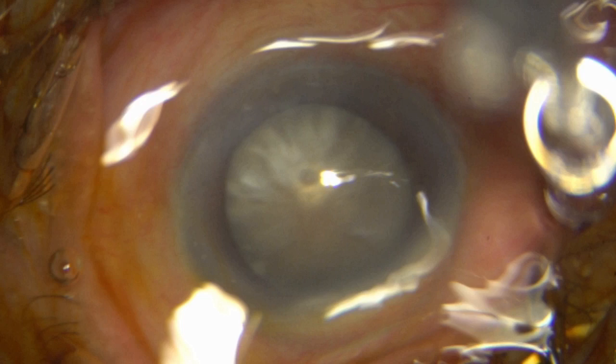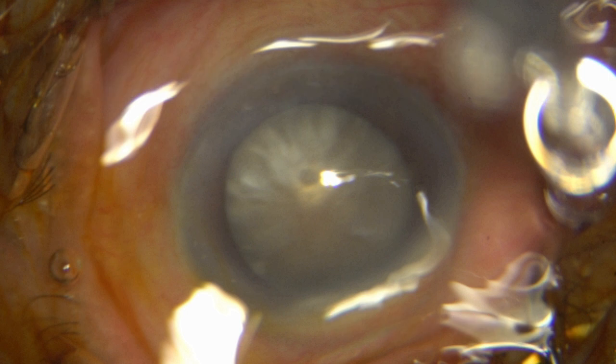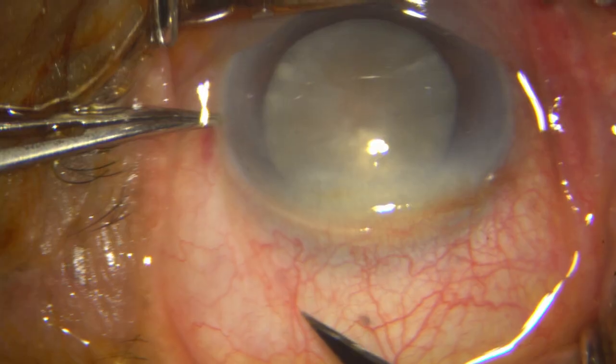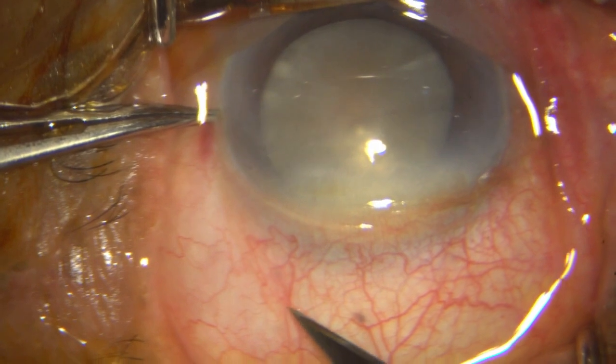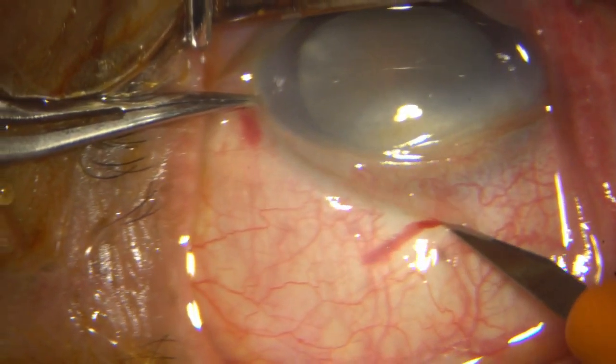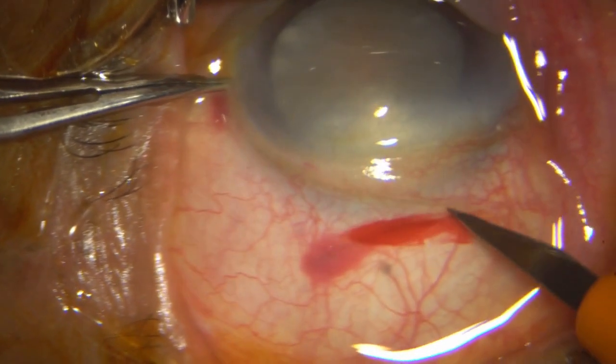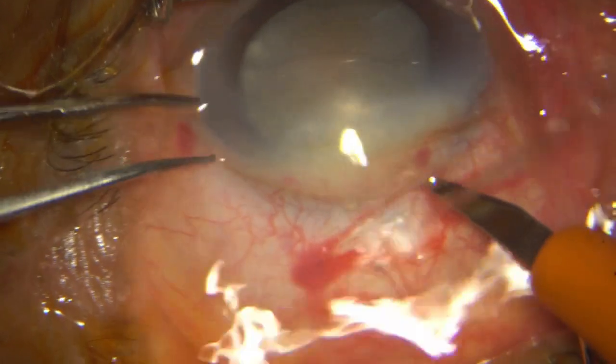This is the fellow eye of an elderly bilaterally blind lady, and I planned for a transconjunctival SICS, and things did get a little bloody, if you can say that. So here I am placing my transconjunctival incision. It's already a very superficial incision groove. I check, yes, it's not been dissected properly.